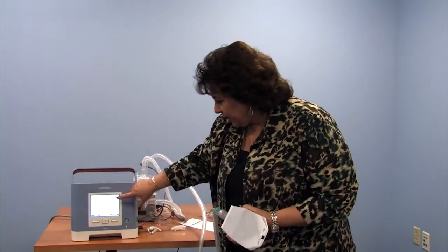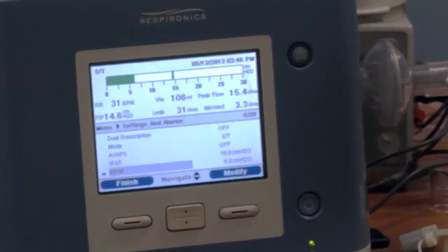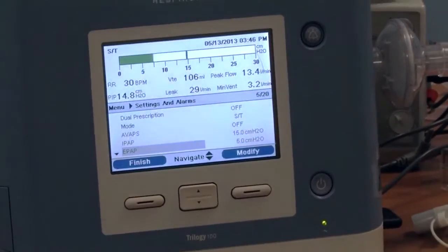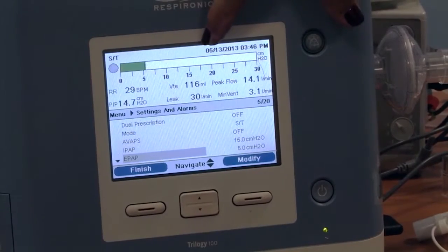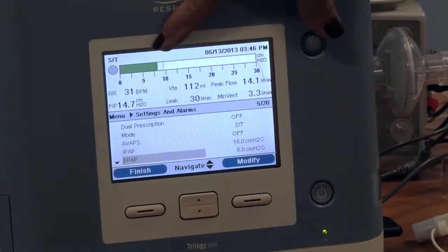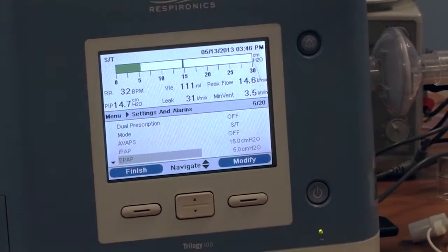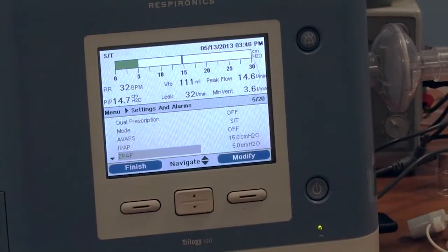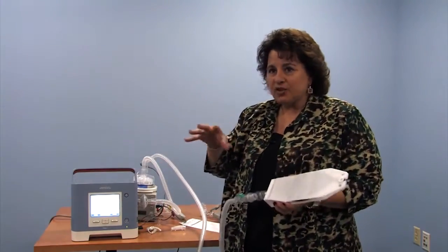So we're just watching that our patient today is getting assistance of up to 15 and down to 5. The 5 would be the PEEP that is ordered by your physician, an amount to help keep the lung expanded between breath cycles. The amount of help that this child needs is up to 15 and down to 5. That difference is 10. That's just math. But remember that there's that language situation between, is my child on pressure support or is my child on BiPAP, and how much are they on?